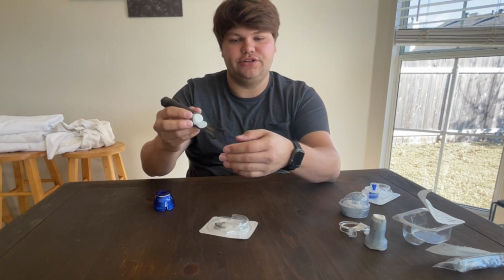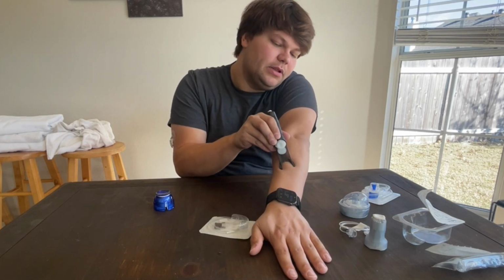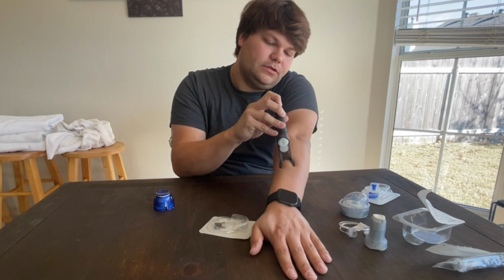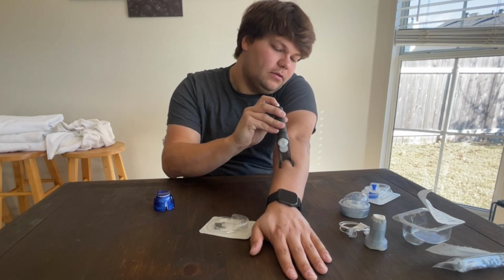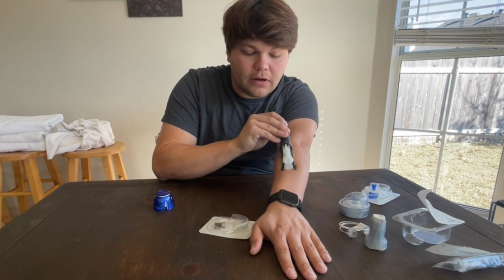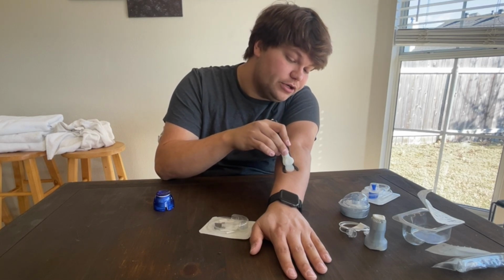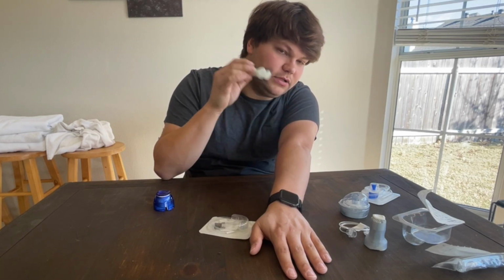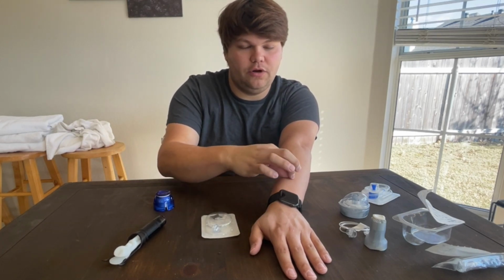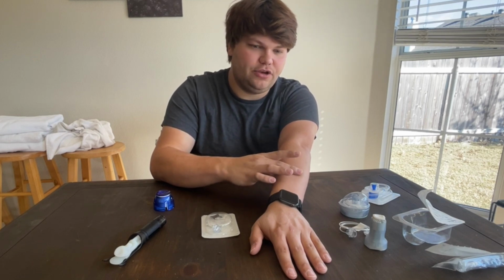So you're gonna get yourself ready. You're gonna take this, and if it were your leg, apply it flat, like that. Twist the lock on the back, and then fire. I guess that's a good way to say it. So then once you've done that, you're gonna push this little bulb and try to wiggle to get the inserter off. Then there are two pieces of adhesive, one on the front, which you do first, and then once you've got the one on the front down, you can hold it.